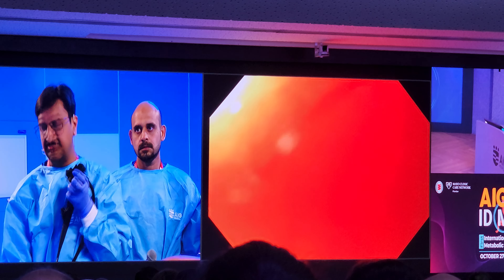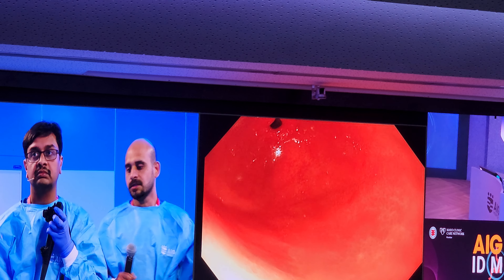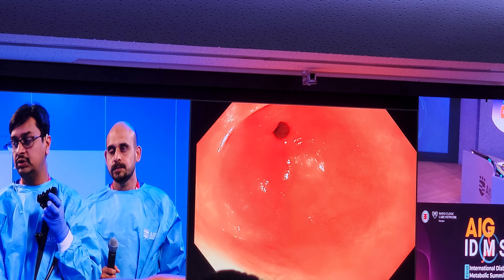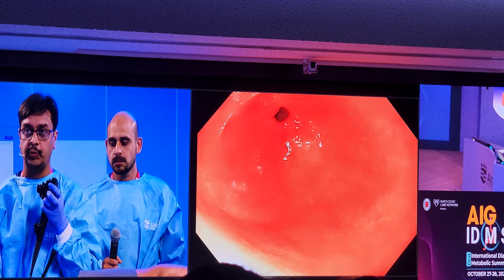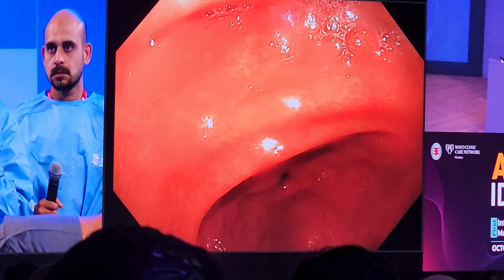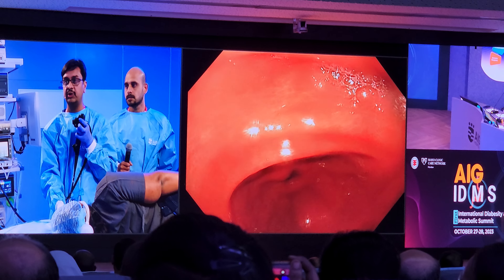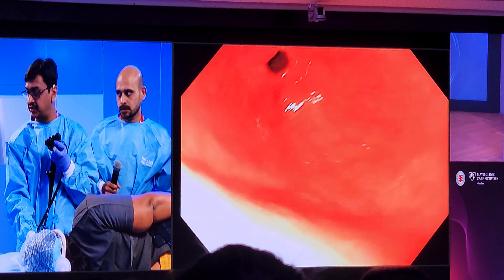We start inflating the balloon. To retroflex and show — the white cord that we are seeing is visible inside the stomach. When we are filling the balloon, we cannot see it being filled because it is on the side of the scope just behind the scope. We are going to fill the balloon with 400 cc of saline with methylene blue, because in case of accidental leakage from the balloon, the methylene blue will indicate it. We have filled 200 cc, 300 cc.